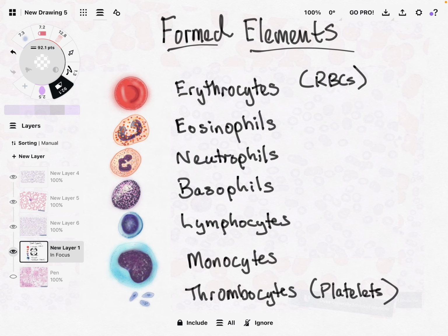They're very large cells. Lymphocytes and monocytes, again, are agranular. It's not to say that their cytoplasm doesn't have anything in it, but it's not big things like these big vesicles that are carrying certain important parts for the function of that cell. So most of what you're seeing is something that doesn't look granular at all, or looks very agranular. Okay?